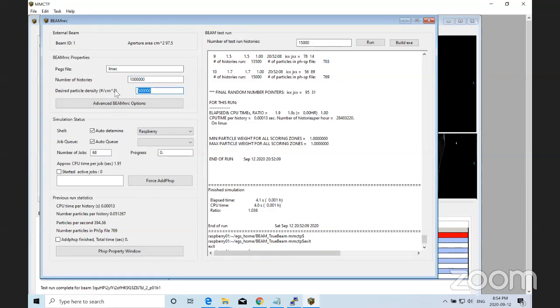And this is, by the way, actually a VMAT, it's not an open field. So the way I do this, this is my personal approach, I don't actually go through calculation of phase space files. The dose calculation we can probably cover next week, but instead of using the phase space file as a source, I actually use a LINAC model as the source. There are advantages and disadvantages to that for sure.